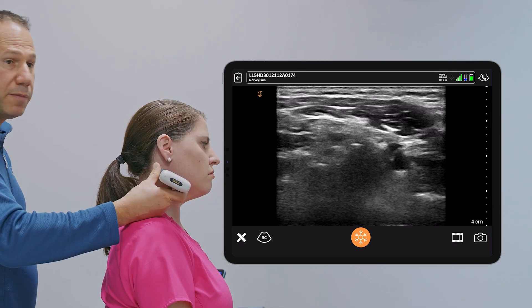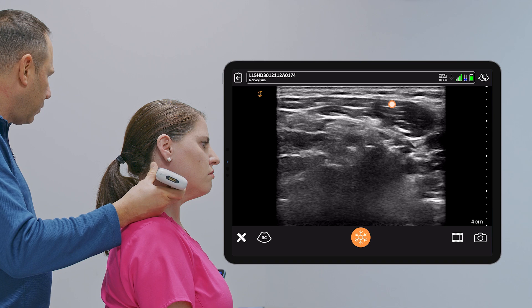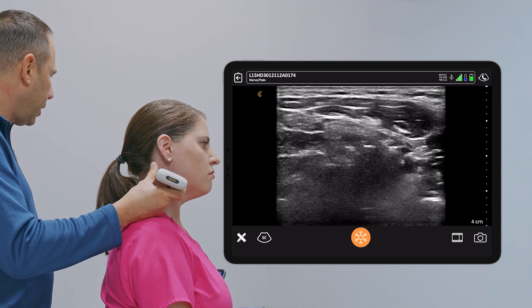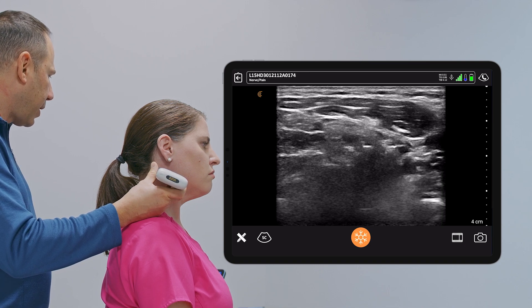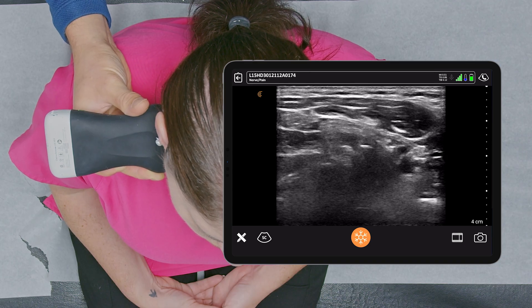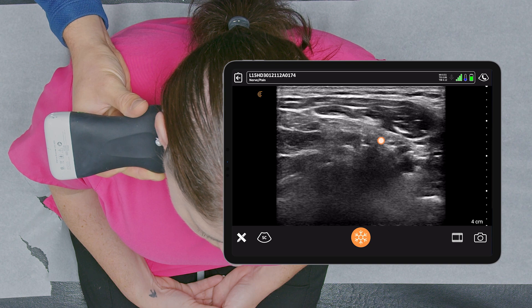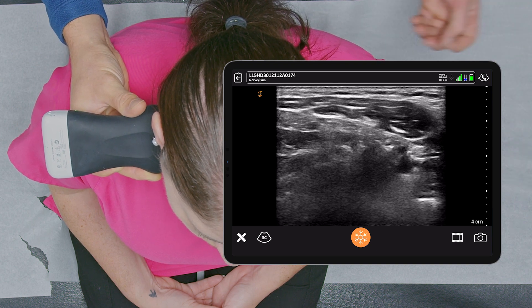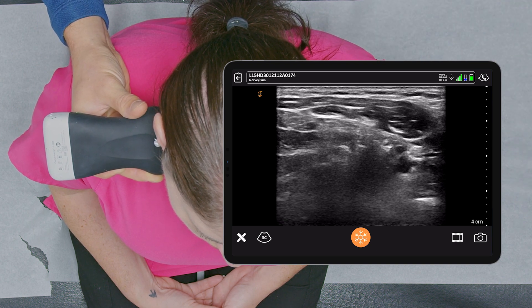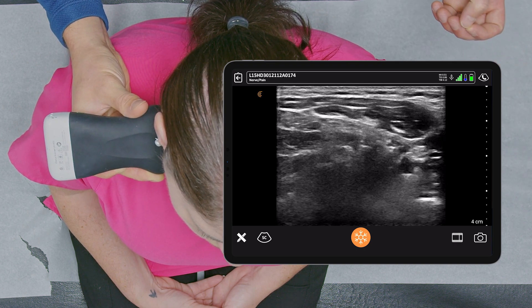We see the sternocleidomastoid, and at this point we could do a deep cervical plexus block by landing the needle on the posterior tubercle and injecting, which is good for surgeries such as carotid endarterectomy.